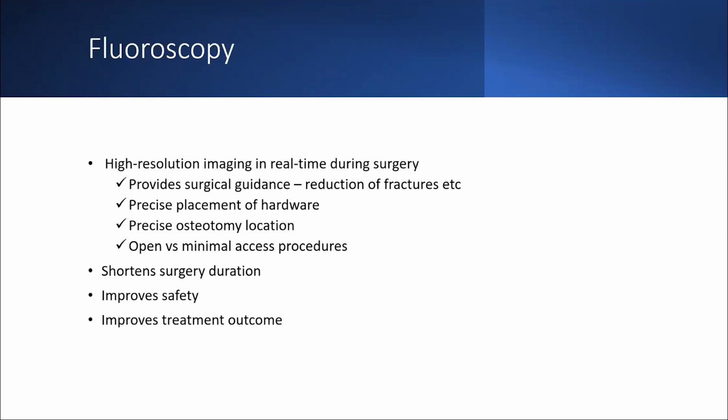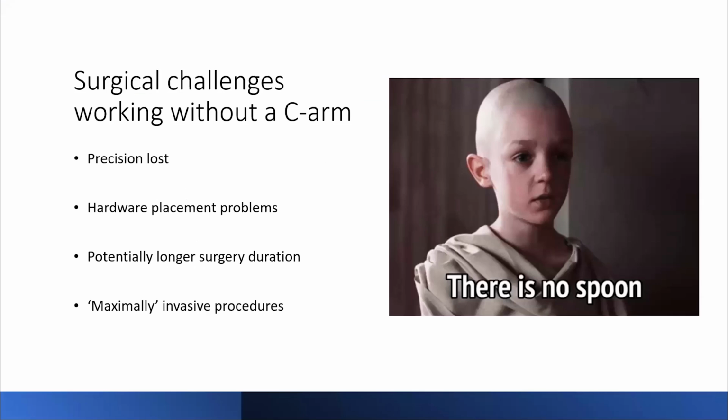It also allows you to do major surgery from a minimal access perspective rather than open surgery. Of course, the consequence of this is that duration of surgery is reduced, and there is improvement in safety and in overall treatment outcome.